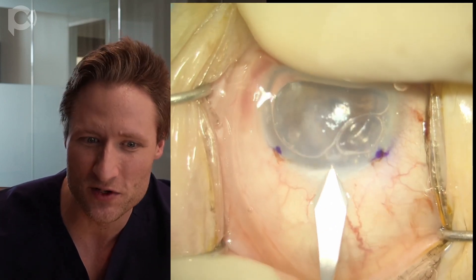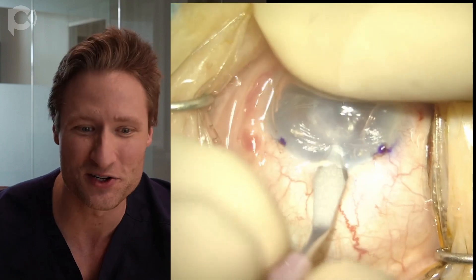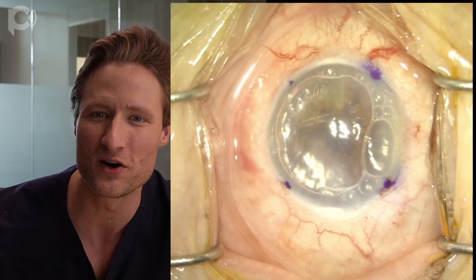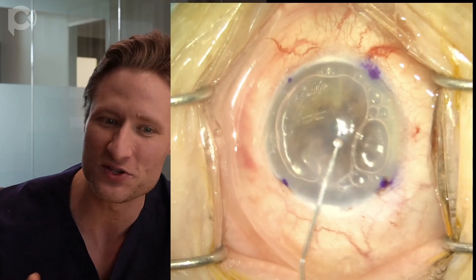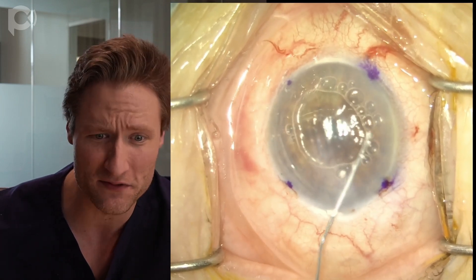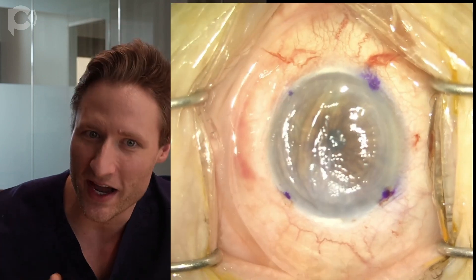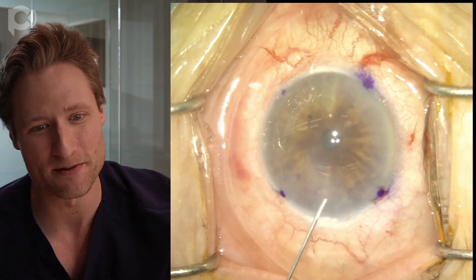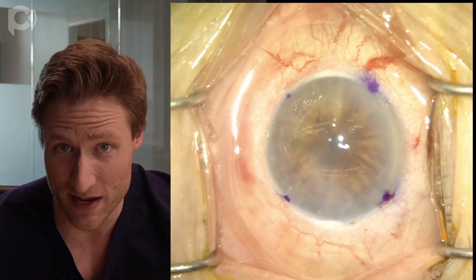Now I'll make the main wound — this is a 3-millimeter keratome. You can use whatever keratome size you want; I actually think it's better to use a bigger wound rather than a smaller wound because it's easier to get the injector in and out. Once I've made the wound, I'm going to remove air from the anterior chamber and replace it with saline, deepening the anterior chamber, and now it's time to make an iridotomy.